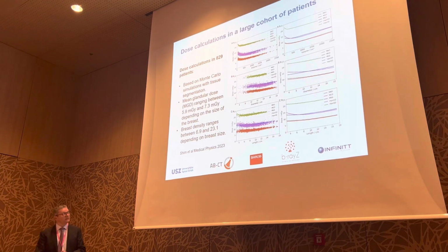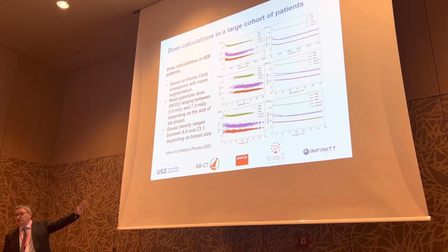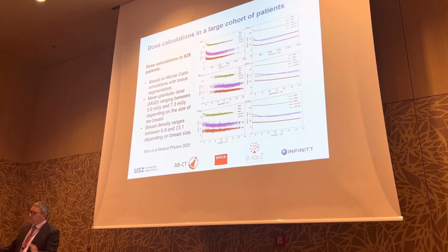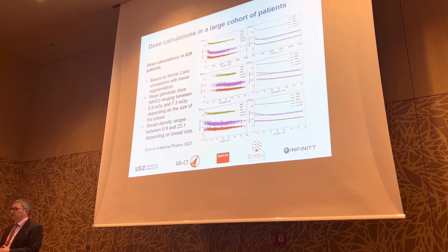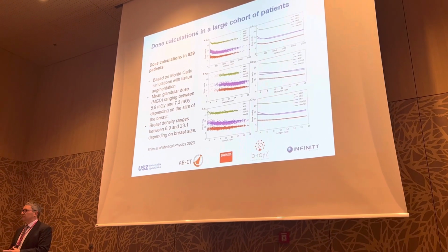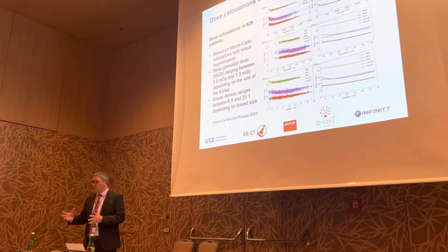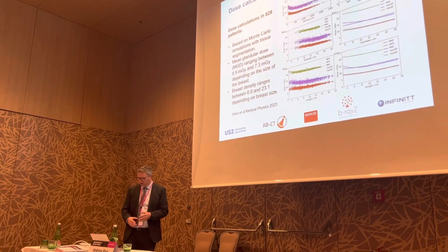The true breast density is in the order of 7 to 23%. The rest is fatty tissue. So even in dense breasts, only about 25% is glandular tissue. The rest is fatty tissue. And this is something that you can only understand if you're doing 3D images.